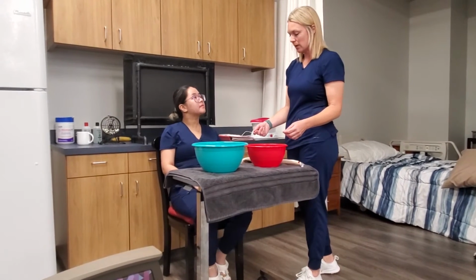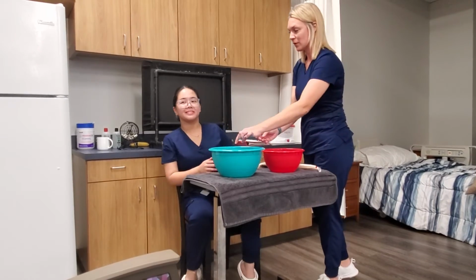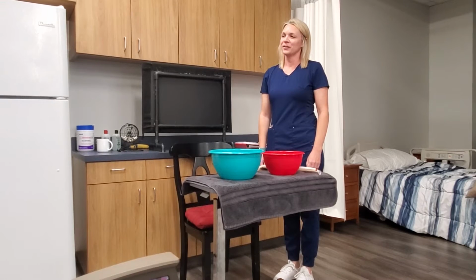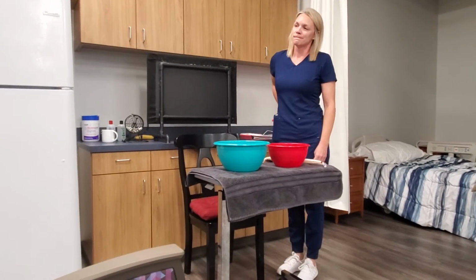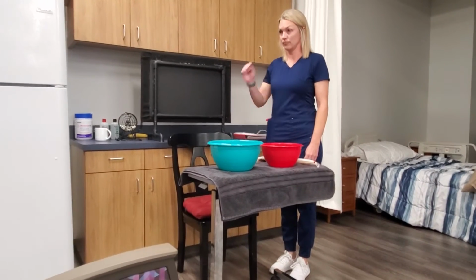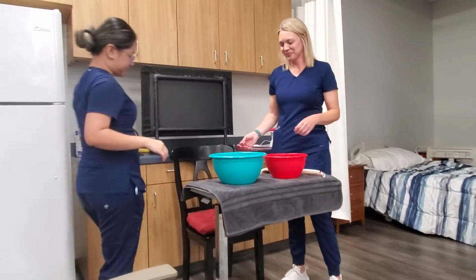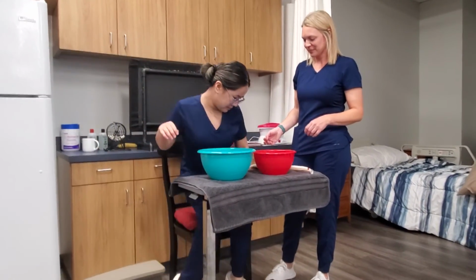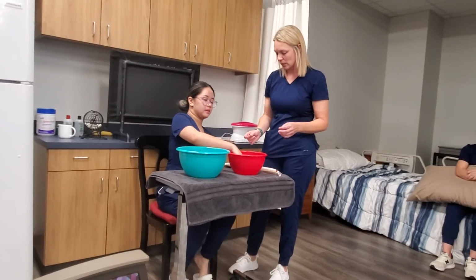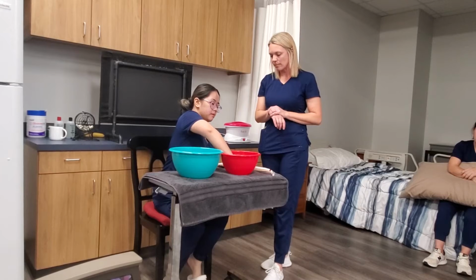Okay, if you'll go ahead and take your right wrist for me. We're gonna start in the hot. Oh, go wash your hands. Oh yes, go wash your hands. Sorry. Miss Wynn, if you'll also take off any jewelry that you have on that hand. Okay, all right. Go ahead and put your hand in then, and you're going to very gently squeeze. We're gonna leave it in there for 4 minutes.